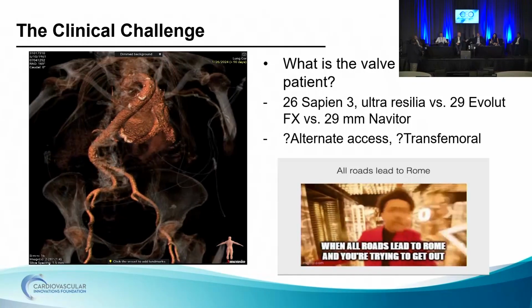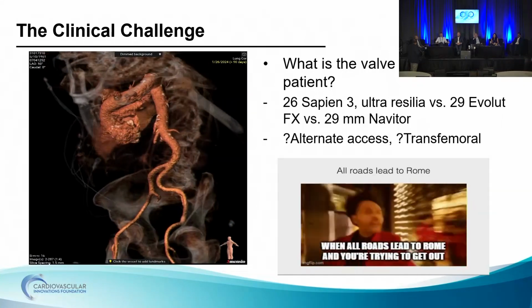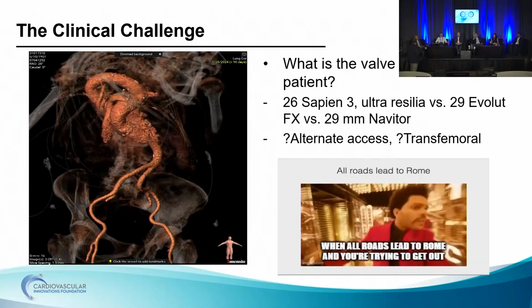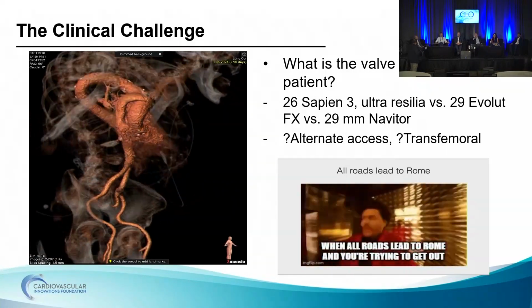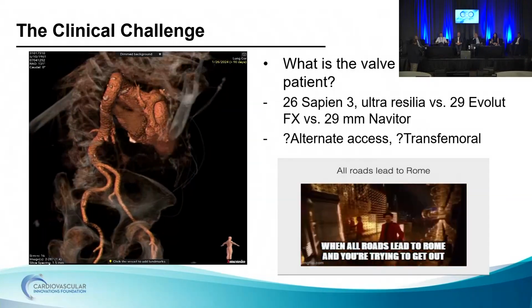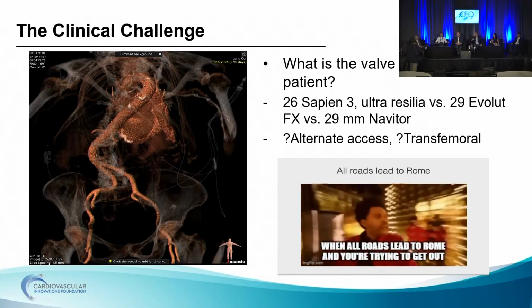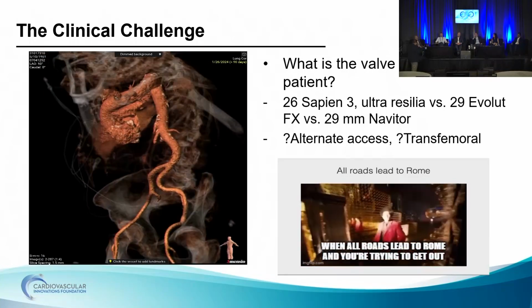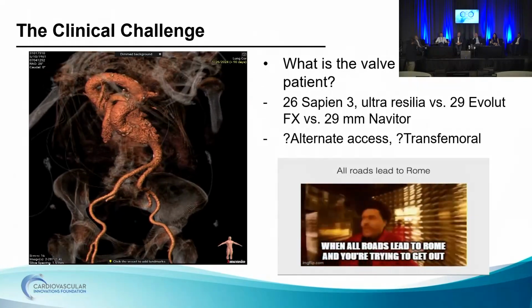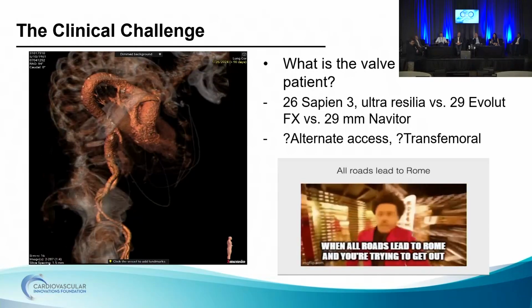Mark. Oh, come on. Well, I would certainly like to see the axillaries before I committed to a transfemoral. I see, because that could potentially be very straightforward. Let's assume the axillaries and carotids are fine. How would you do this TF? I'm trying to think what device I would use and whether the ability to flex my device might help some. The relative lack of calcium is nice.